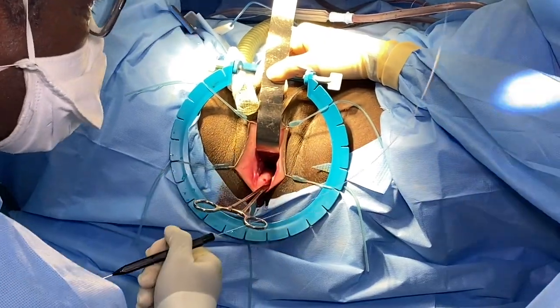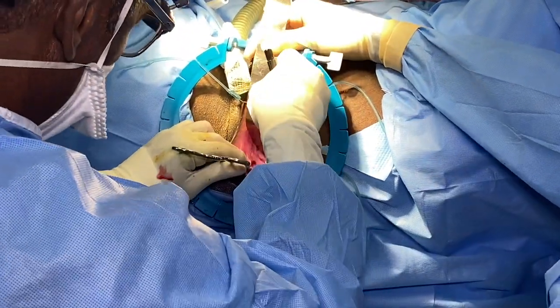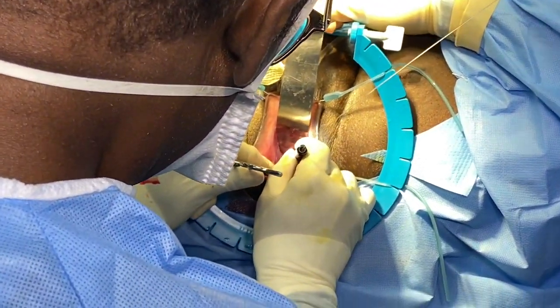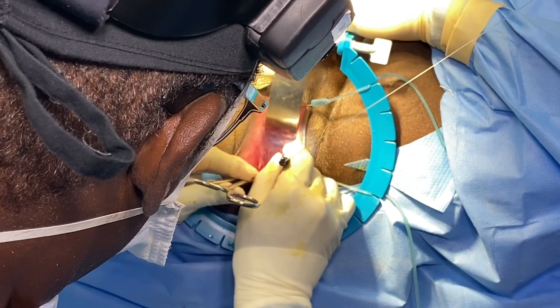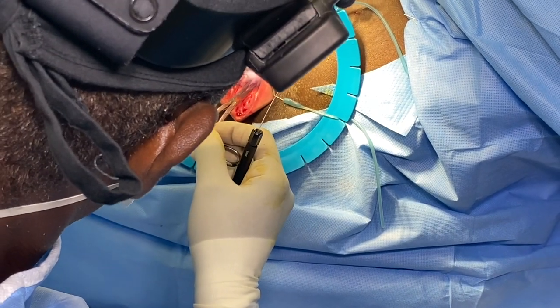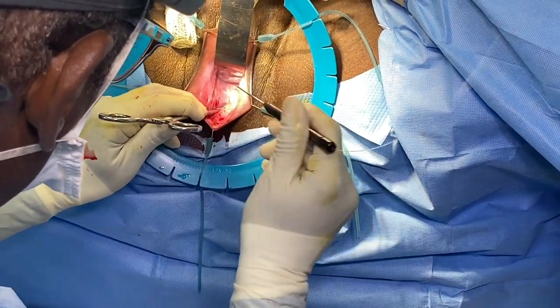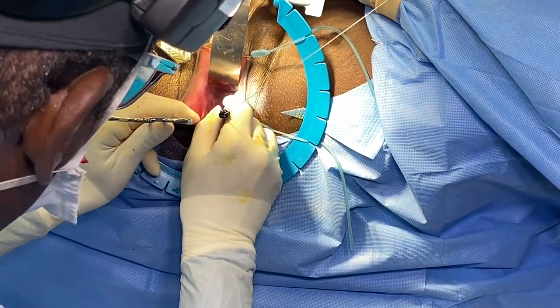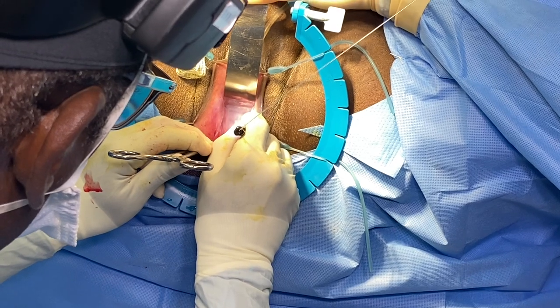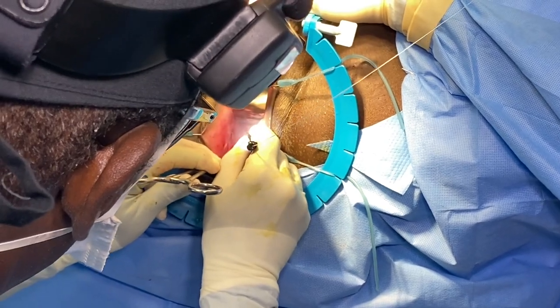Okay, we're going to make the first incision point now. The laser is used to do all the cutting and dissecting. We're working on the anterior wall, that's the top. What I'm holding is a cervix. I'm going to make the laser incision here. Alright, laser incision. It's really 2 centimeters up from the external cervical os. That's the opening of the cervix.